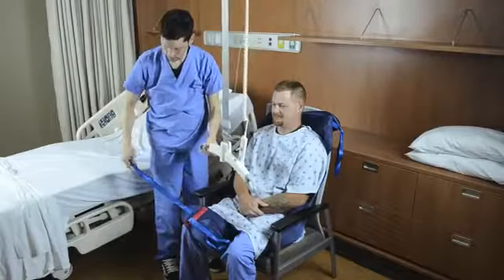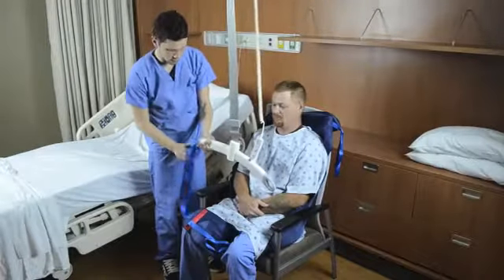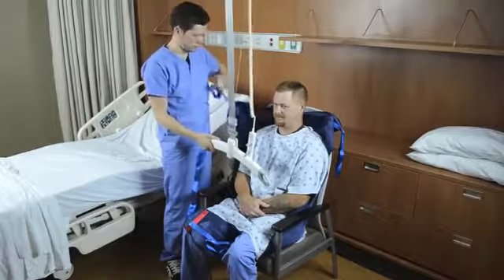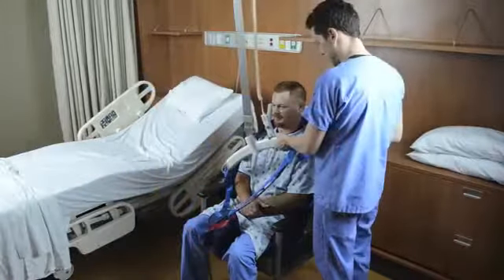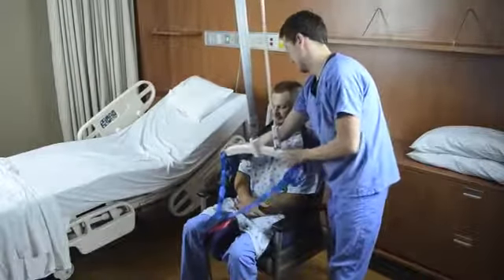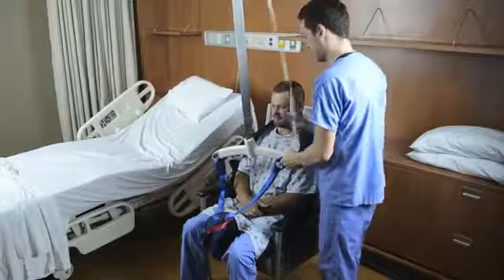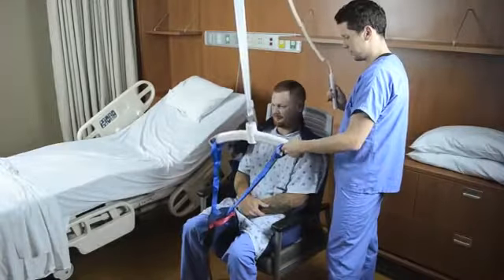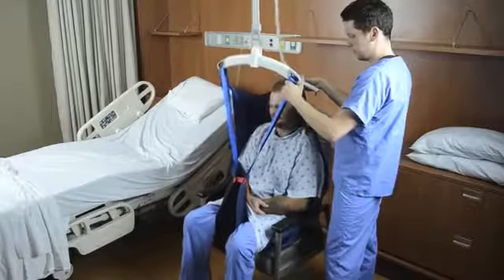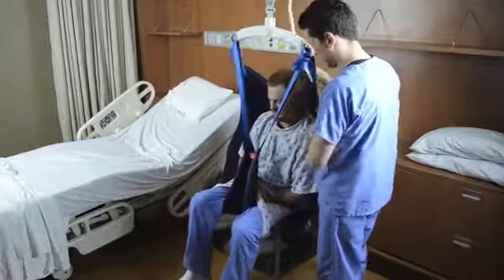Attach the four lifting straps from the sling to the hooks on the carry bar. Make sure the sling straps are secure. As shown, by attaching the sling straps on the longest loops, the patient is raised in a high back or seated position. The patient is easily tilted or reclined back by moving to a shorter ladder or color loop on the leg straps.